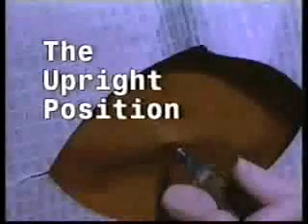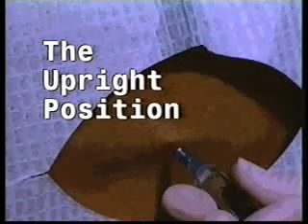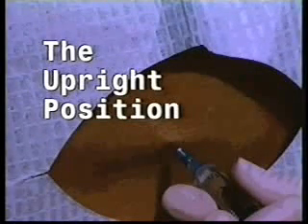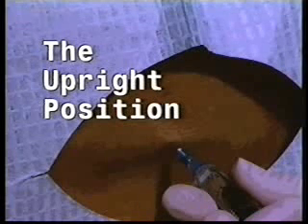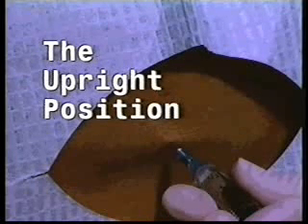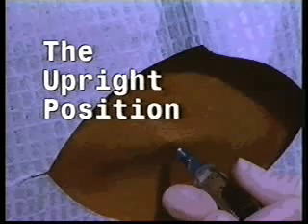Use this method to find your target site. The advantage of using the upright position is in the ease of access to the landmarks and site with minimal need for patient cooperation. Patients who are obese, have breathing disorders, or who have obscured landmarks may benefit from this position.